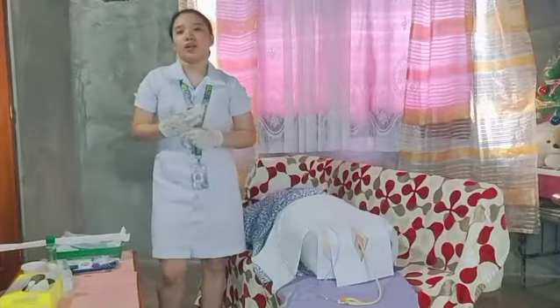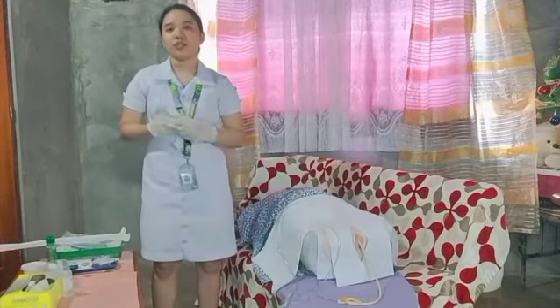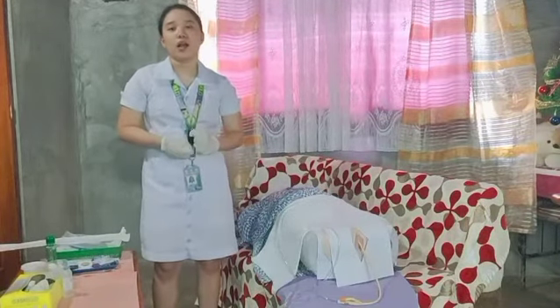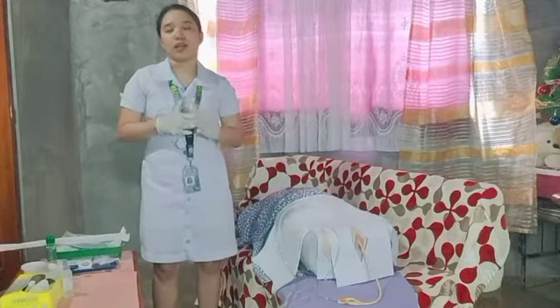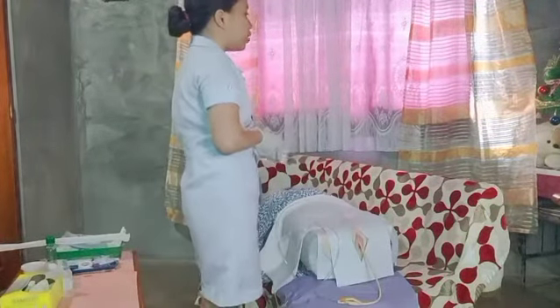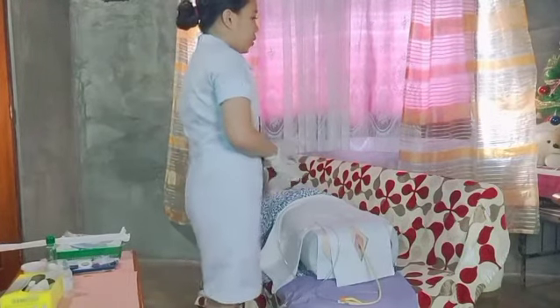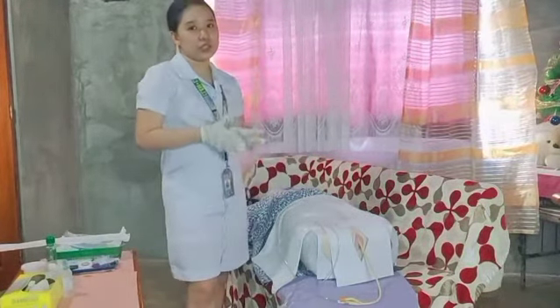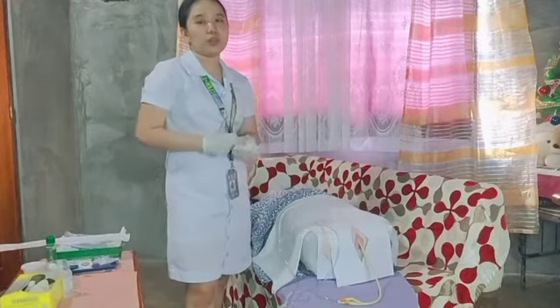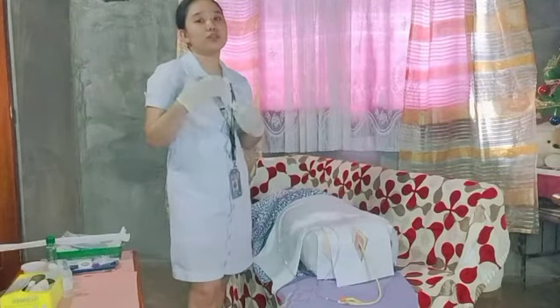So, now we are ready to remove the catheter. But first, you need again to verify the doctor's order, o kailangan pa natin ng signal ng ating doctor. So, ma'am, i-remove na po natin yung inyong catheter. Ready na po ba kayo? Okay, so, we are going to use the syringe to remove the fluid from the balloon and pinch the catheter and pull it out smoothly in a rotating motion.